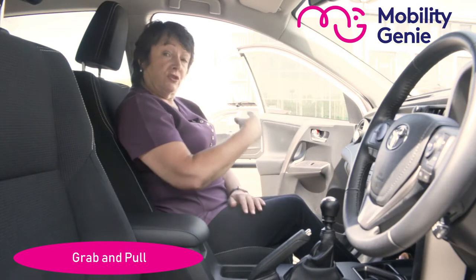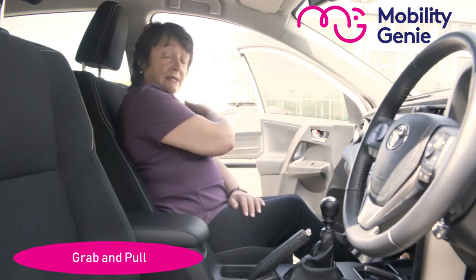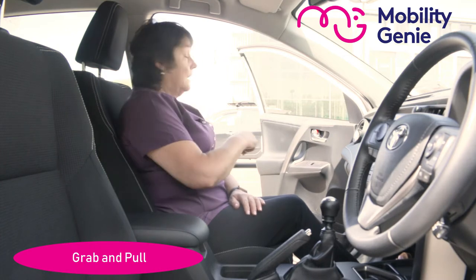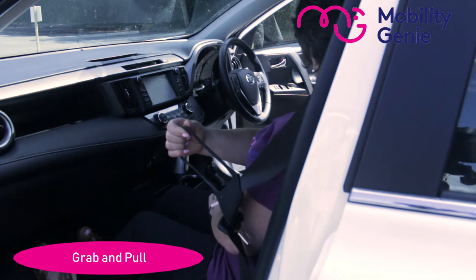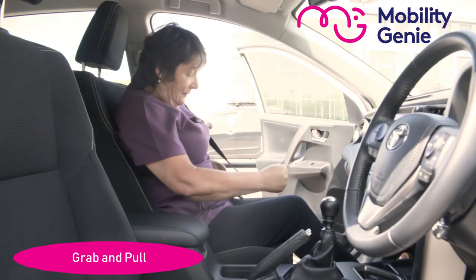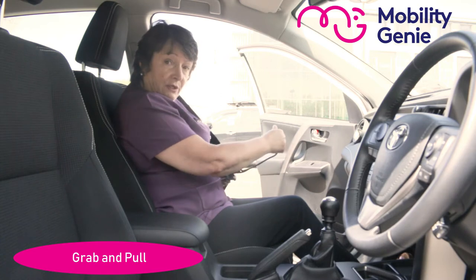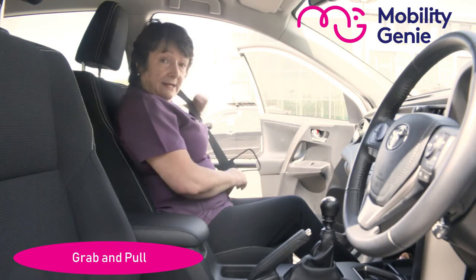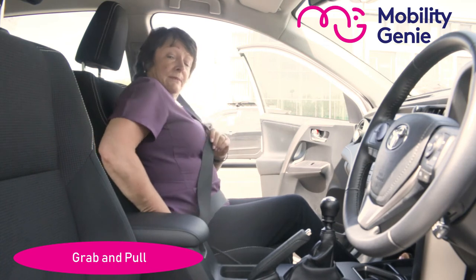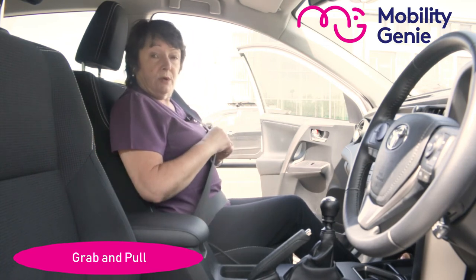You know the way you have to reach to catch the seat belt, to pull it across you and buckle it in place? With this you simply catch the grab and pull — you grab and then you pull — and that brings the buckle closer to you so that you can complete the task of fastening your seat belt. The grab and pull would be positioned in the upper part of the buckle.